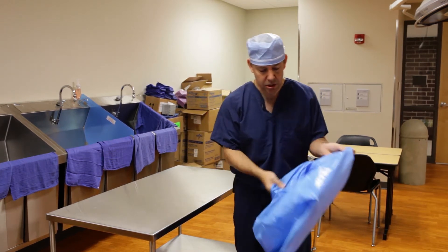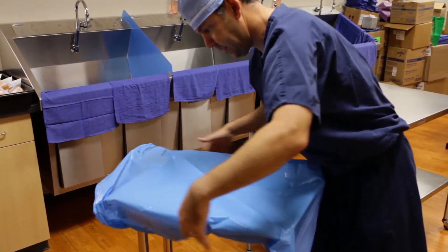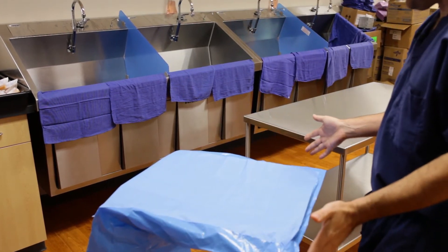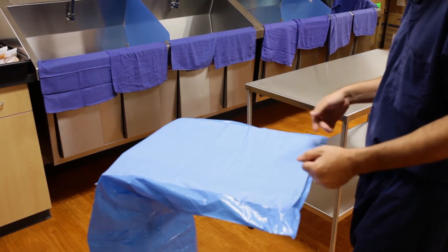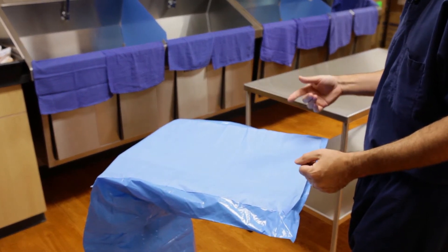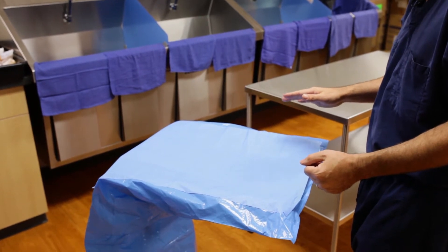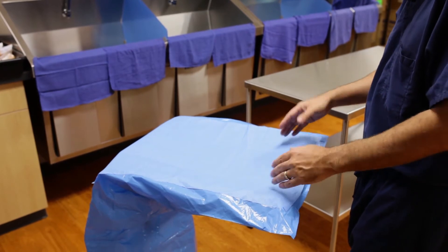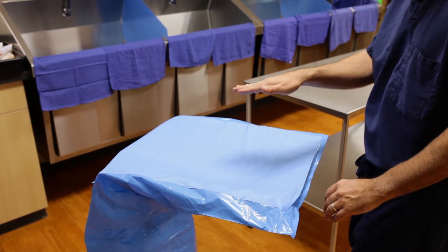I'm going to go ahead and just put the Mayo stand cover on, just to show you how I would refold it. We've just placed our Mayo stand cover and we have to refold it properly so we can keep using it over and over again. The step that I think is most important to remember is when you are fan folding the Mayo stand cover, make sure you fan fold on top and keep stacking it on top.